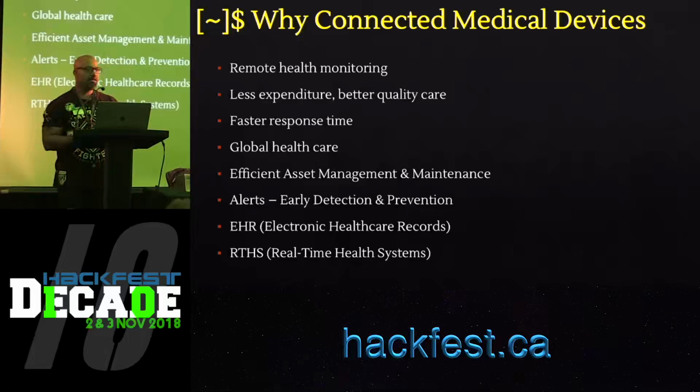So we were kind of stuck again, and at this point, we did what you typically do to a template. We filled it. We filled it with our favorite wireless settings, and then ported it back to the infusion pump over IRDA. And out of everything else, that worked. Once we ported it back to the infusion pump, it just overwrote all its wireless settings with the settings from our template. So at this point, we configured it with the username and password.